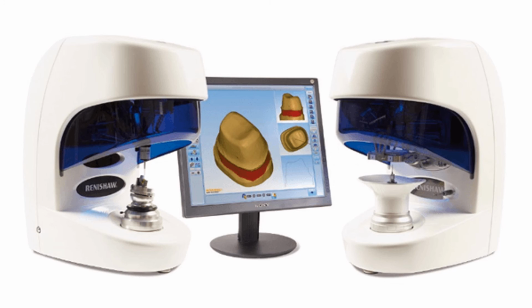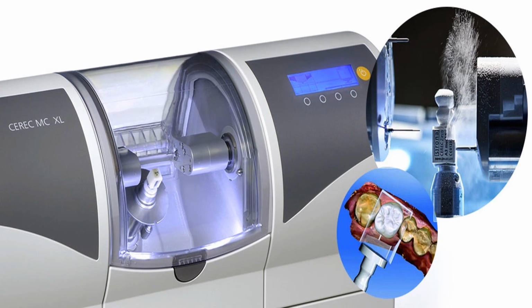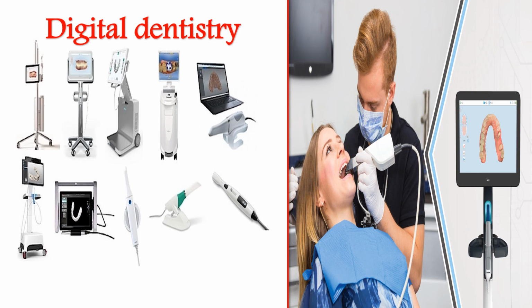CAD/CAM is faster, more economical, predictable, consistent and relatively accurate. All components of the CAD/CAM system are located in the dental surgery. Fabrication of dental restorations can take place at the chairside without a laboratory procedure. CAD/CAM saves time and offers the patient indirectly fabricated restorations at one appointment.